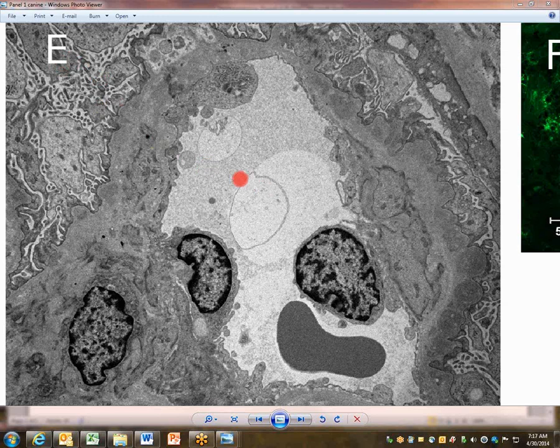The other thing is that you're correct about the irregularity of the thickness, but the irregularity is mostly on the subepithelial or abluminal surface, and is attributable to the response of the GBM matrix production by the cells in the field, in this instance, surrounding the electron-dense deposit, and here as well.